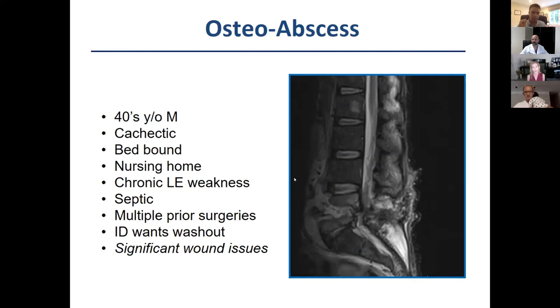this is a very difficult case because you can see that he has essentially no anterior column there. It's just gone. And as Coy said, it's mush. Posteriorly, it's kind of hard to tell, but he's had prior surgeries there before. There's tons of scar tissue. Everything there is significantly stenosed and compressed. He probably has, I'm assuming he has, a big sacral decubitus ulcer there or something just horrible. Not yet, but... But you have to decompress and stabilize this guy, right?